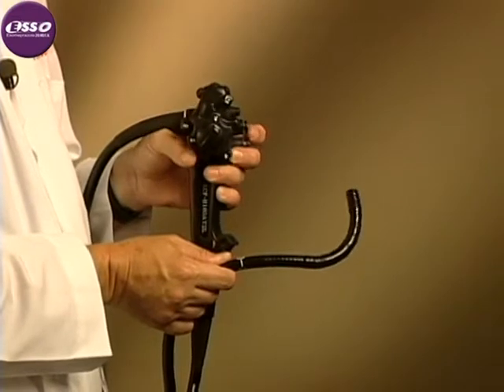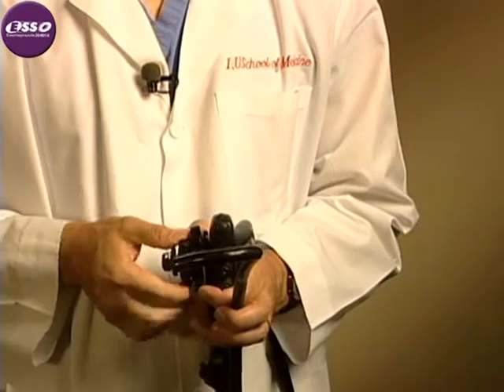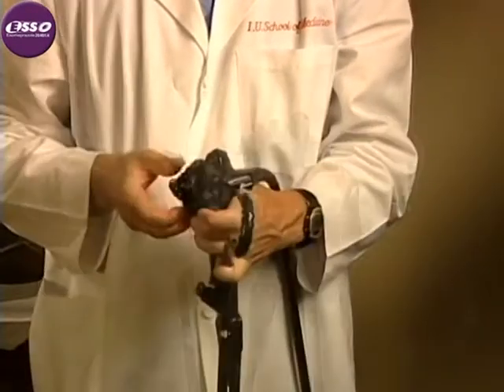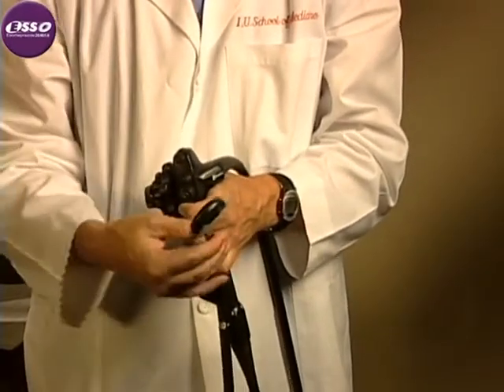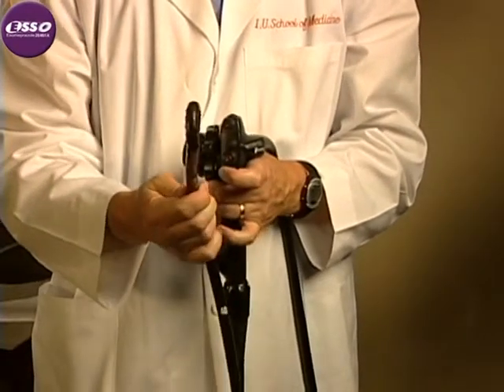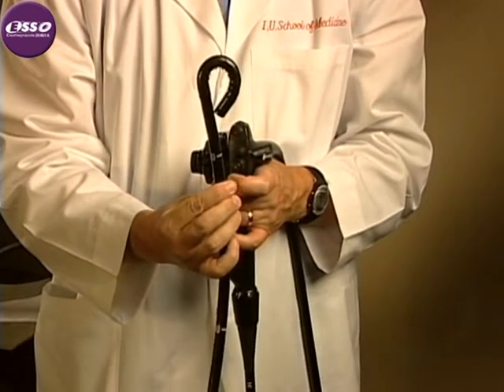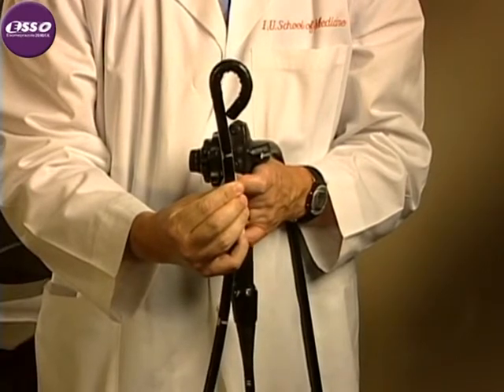There is one additional point that I would like to make about tip deflection that is very important during colonoscopy. We discussed earlier that we can deflect the tip 180 degrees in the up-down direction and 160 degrees in the right-left direction. However, if we initially deflect the tip maximally in the up or down direction and then maximally deflect the tip in the right or left direction, the scope tip will hairpin. That is, it will look back at itself, but it will deviate very little from the up-down plane. This can be extremely useful in passing very sharp turns.